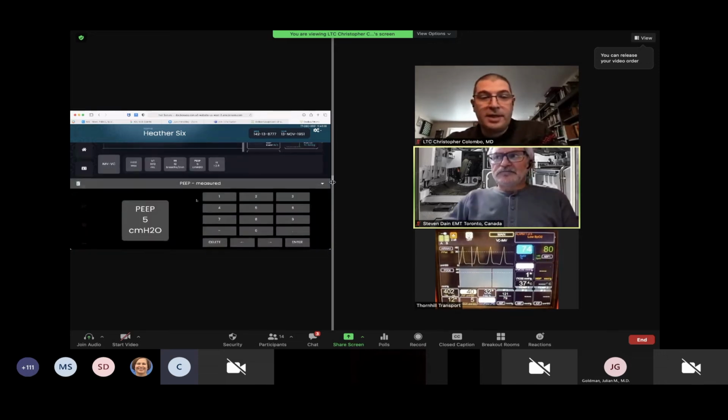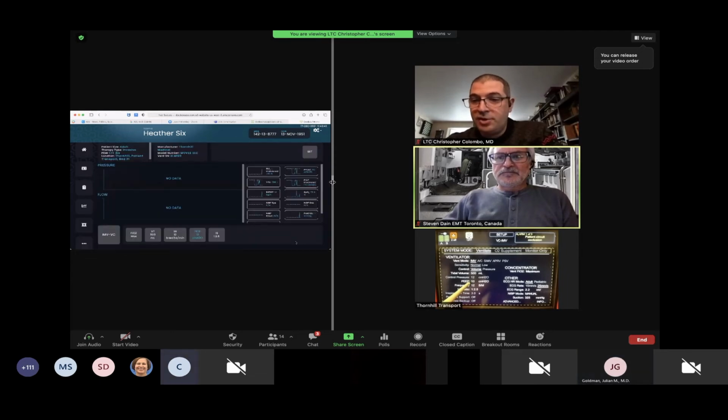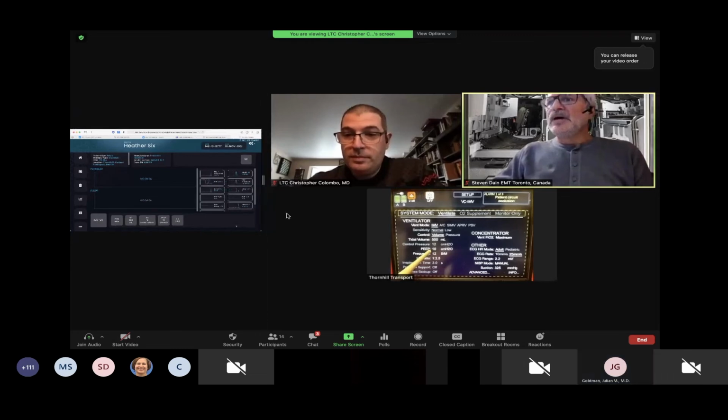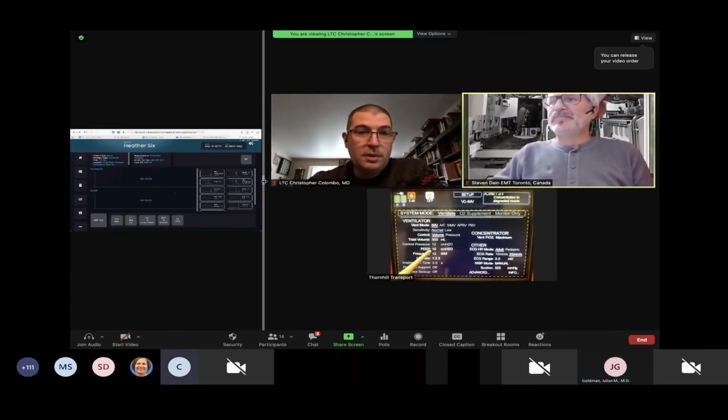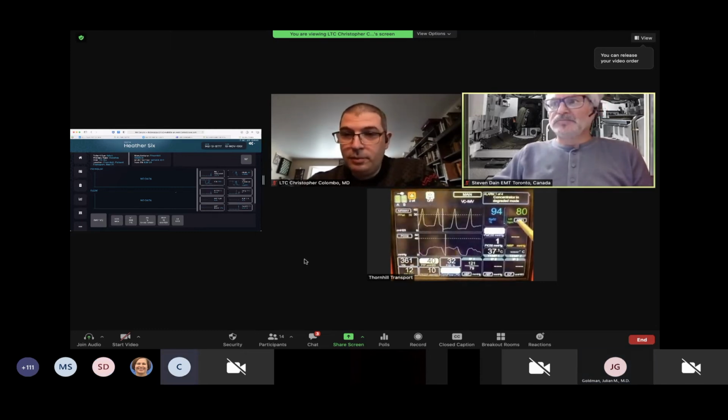I'm going to go ahead and make a second change. So I'm going to open up the positive end expiratory pressure for you. It's set at 5. I'm going to turn that up to 10 to see if we can open up a little bit more lung. So I've made that change. Can you verify? Yes, I can see that on our monitor here. Okay, and I will stay at 10 centimeters of water with you. Excellent.